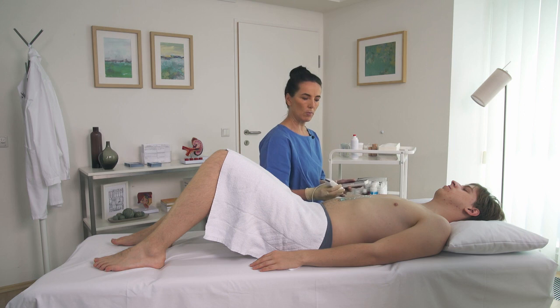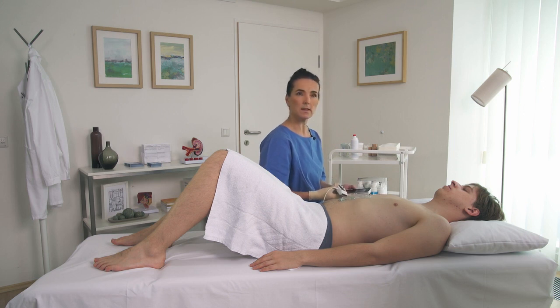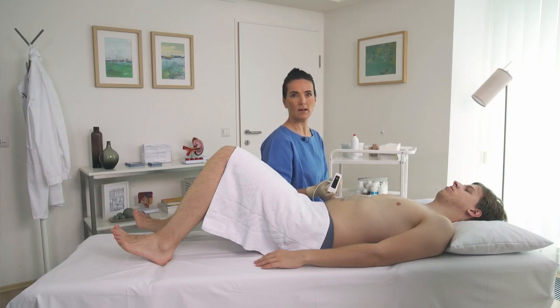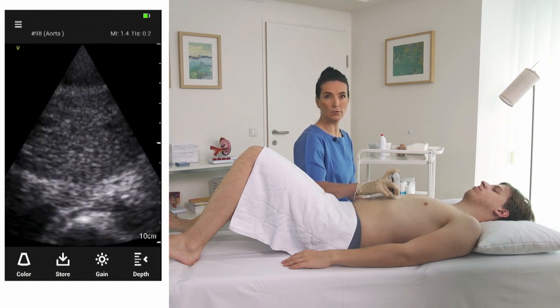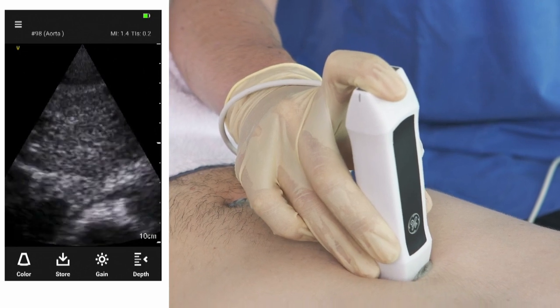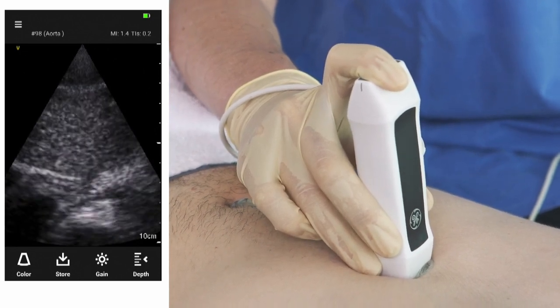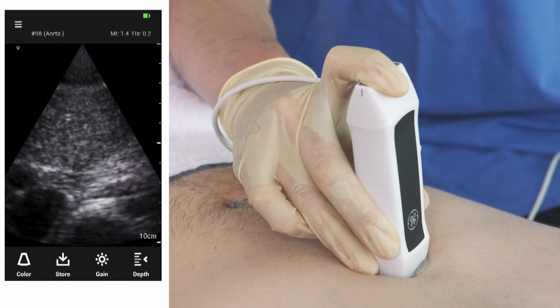Taking the probe now, I ensure I have the right program. In this case, the device offers a program called aorta. So let's start the protocol of scanning the abdominal aorta just below the xyphoid area — the area where the thoracic aorta passes through the diaphragmatic hiatus into the abdominal area.